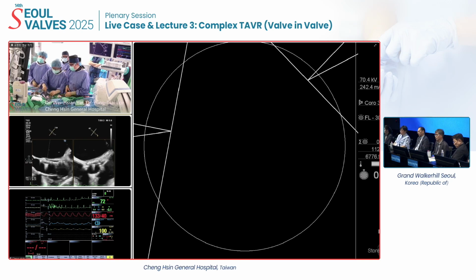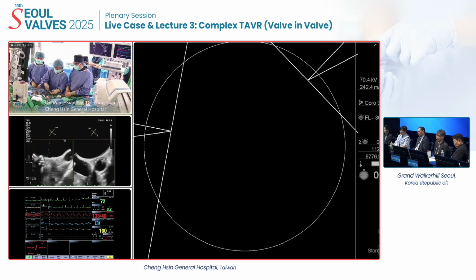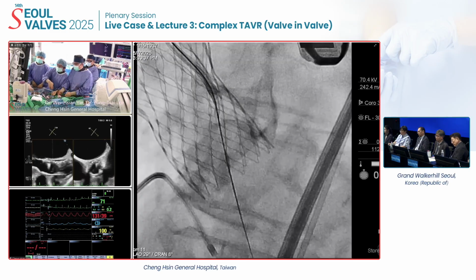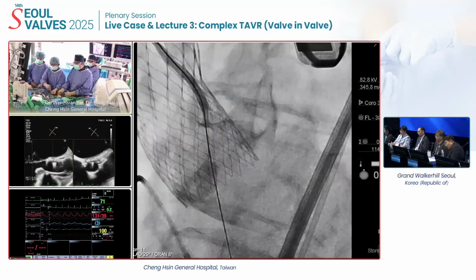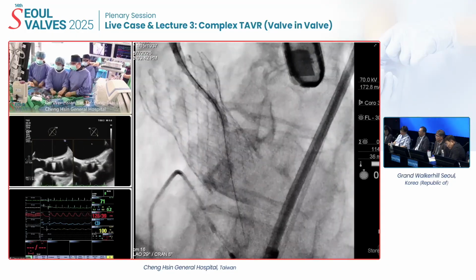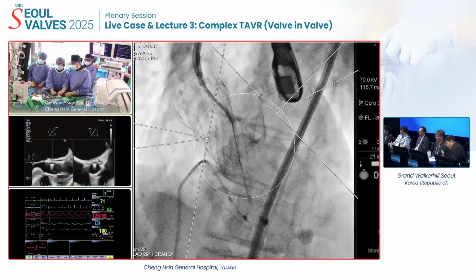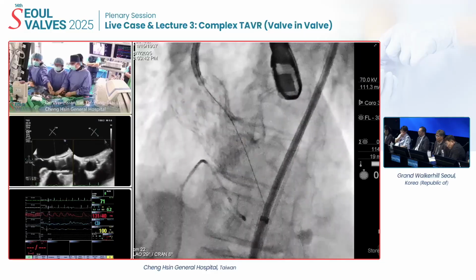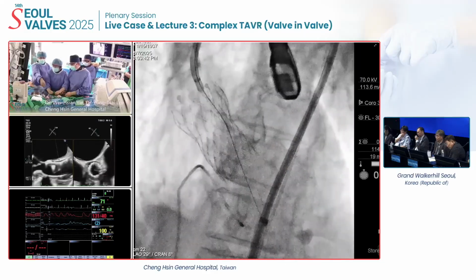But if the patient has a risky procedure for both coronary arteries, basilica on both sides is a better option, or even use the ShortCut device. I just wonder who of you has experience with ShortCut, and maybe you can give some comment on this.